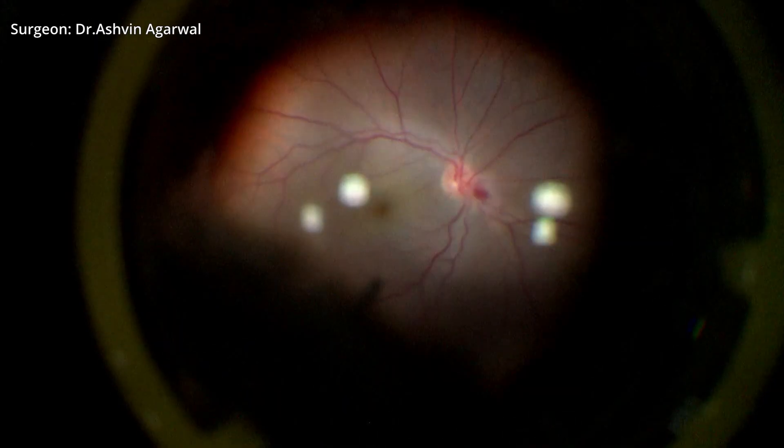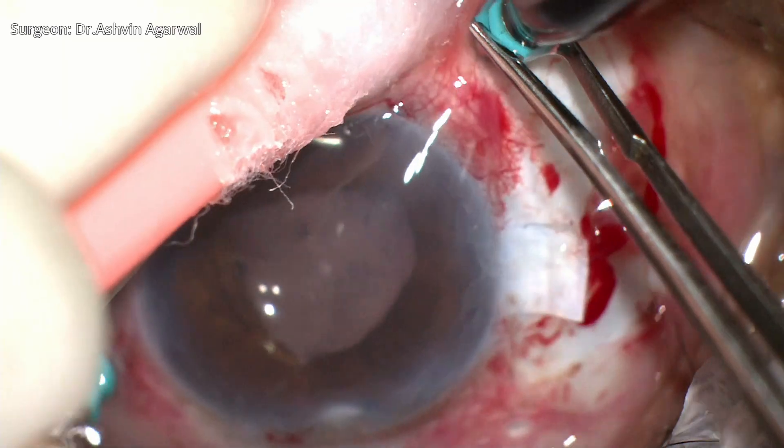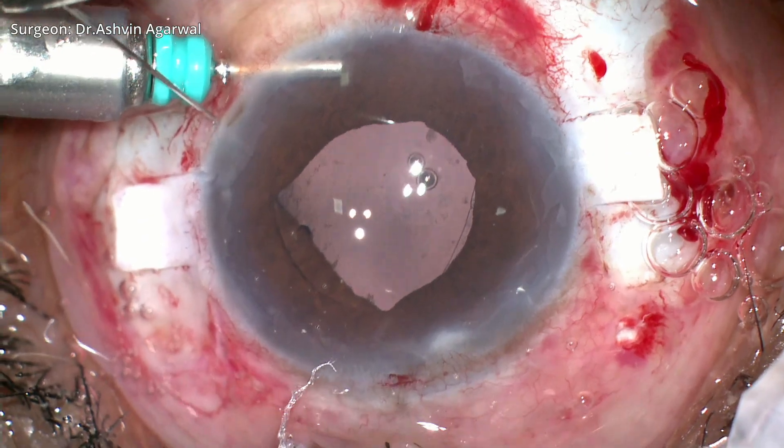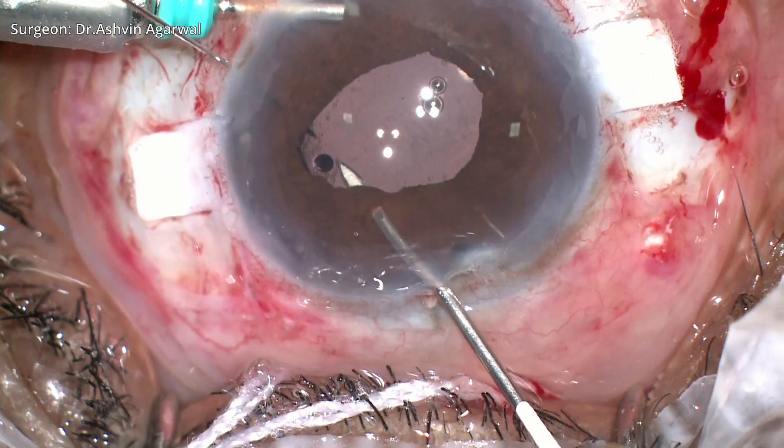The posterior segment is examined to rule out any hemorrhages, tears, or breaks. Once the glued IOL is done, we proceed with performing the single-pass four-throw pupilloplasty technique.